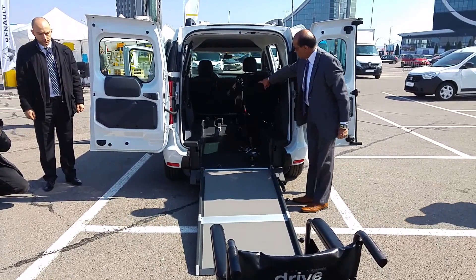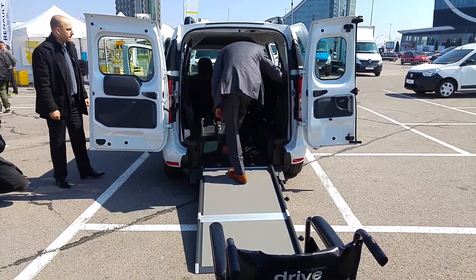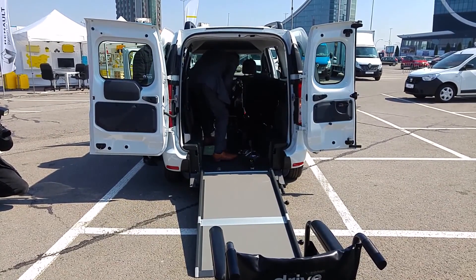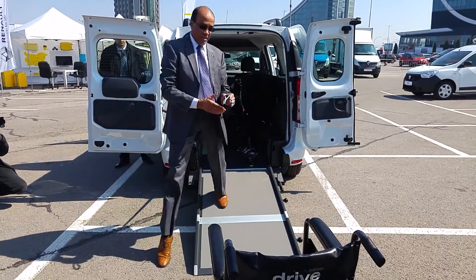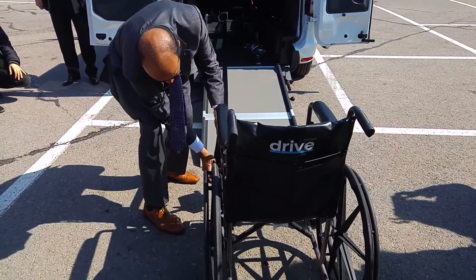What you have inside is a flap. So that would fit onto the wheelchair vehicle.